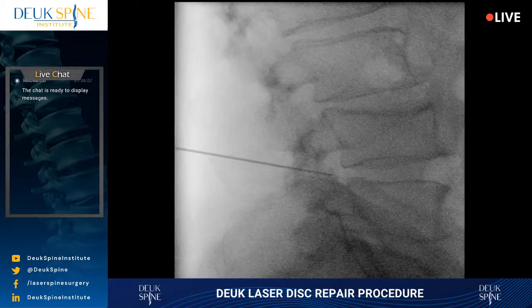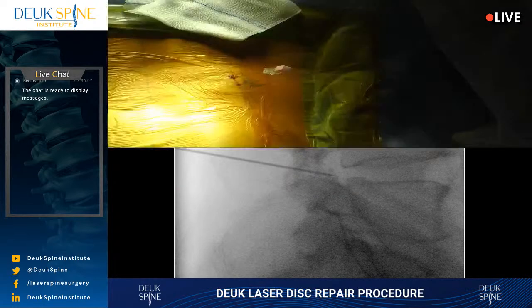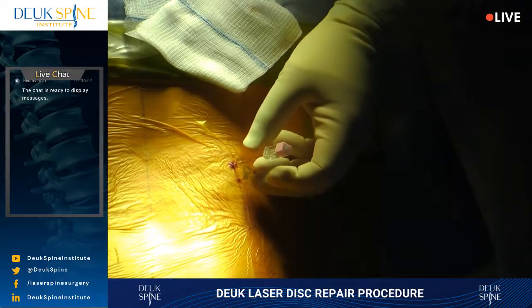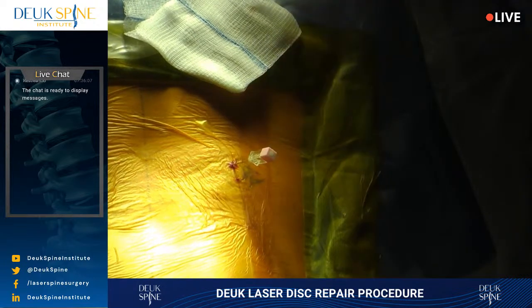Shot. So I like to come in low in the foramen. You comfy? Yes. Shot. All right. We're aiming once again for L4-5. Shot.